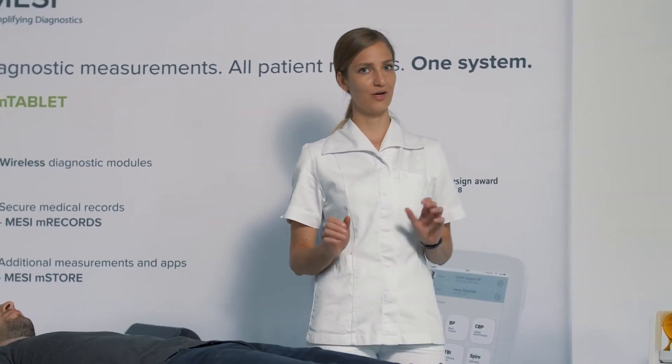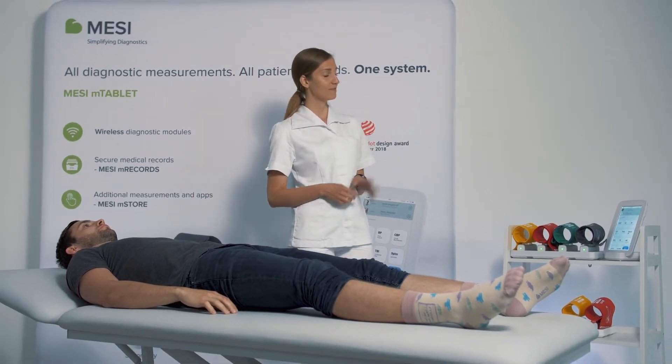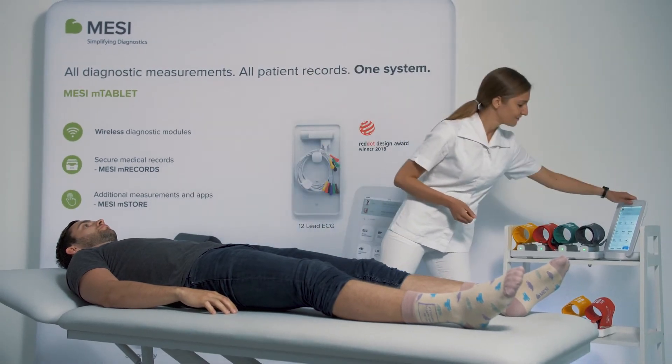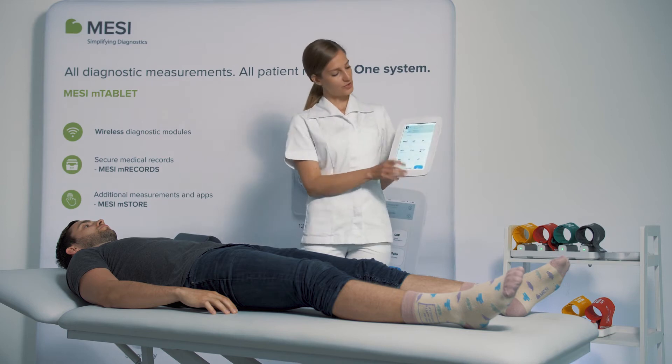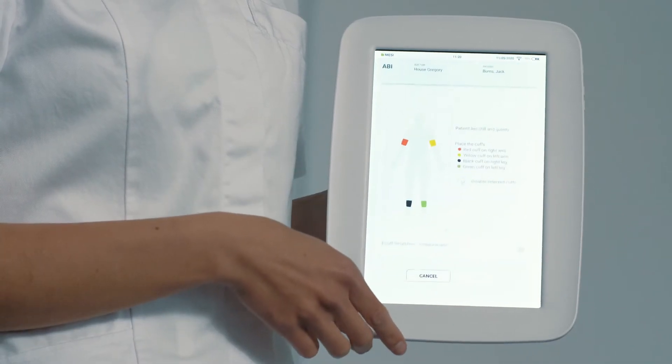I will show you how to perform a quick, easy and reliable measurement of ankle brachial index with MISSI M-Tablet ABI. After choosing your patient on the M-Tablet, you choose the ABI application.